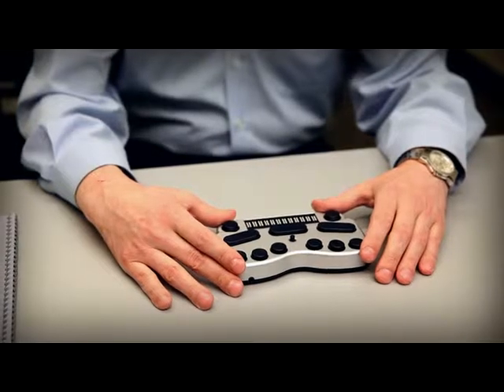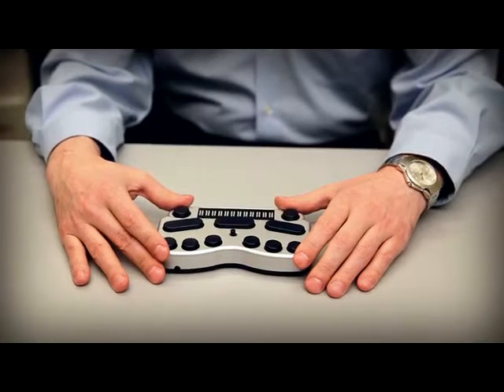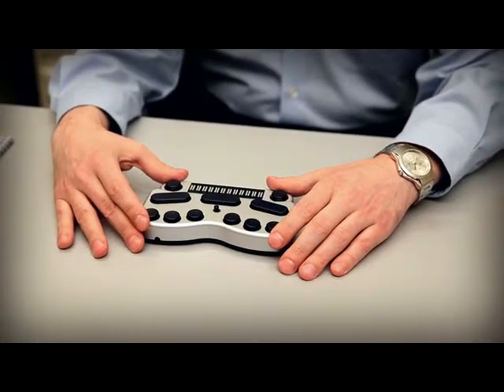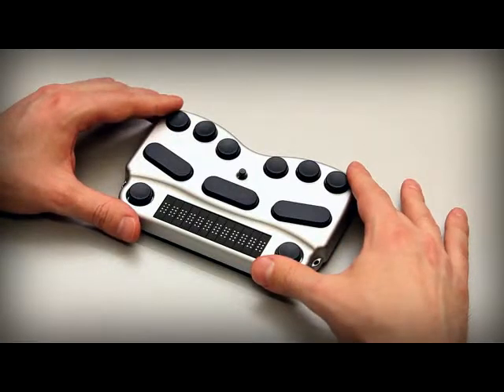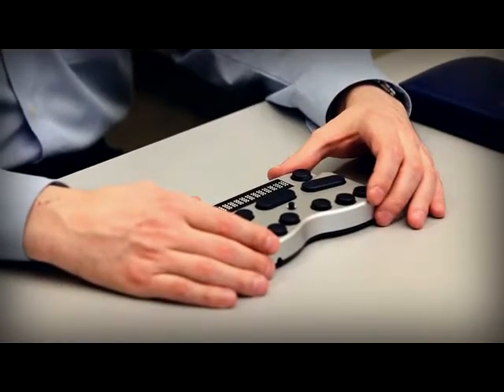The next beep tells you the battery level. Three beeps for fully charged, two beeps for 50% charge, one beep for low battery. The final sound is a chirp to confirm that Bluetooth is active. And that's the Braille Pen 12.